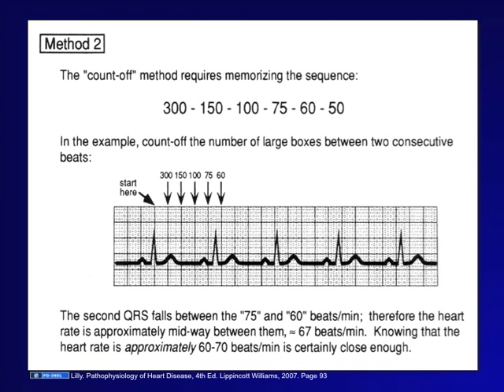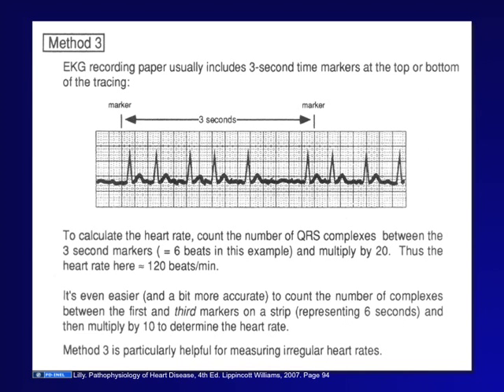Sometimes the heart rate is irregular, so use a different method: count 15 large boxes, which is three seconds, and count the number of QRS complexes in that span, then multiply by 20 to get beats per minute. For example, if you count six beats in three seconds, that's 120 beats per minute. So there are three ways to calculate heart rate: the 1500 method, the big-box estimate, or the 15-box count multiplied by 20 for irregular rhythms.